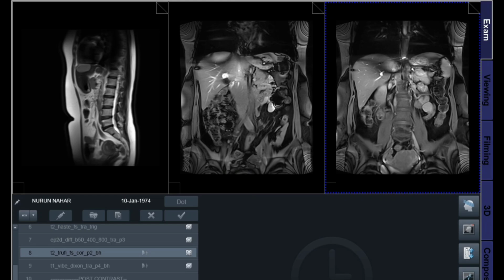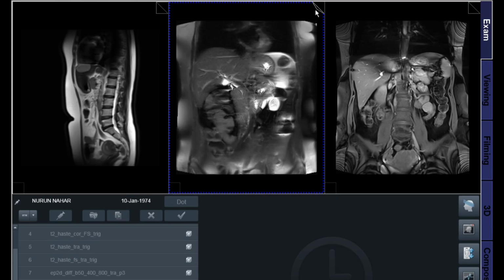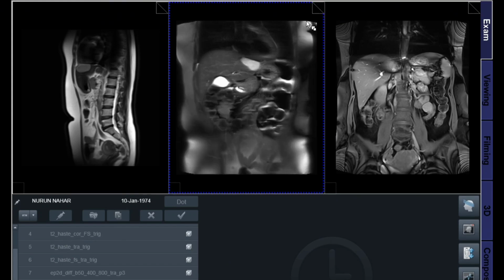Contraindications. MRI is contraindicated in patients with non-MRI compatible pacemaker, cochlear implants, ferromagnetic foreign bodies, severe claustrophobia, relative.